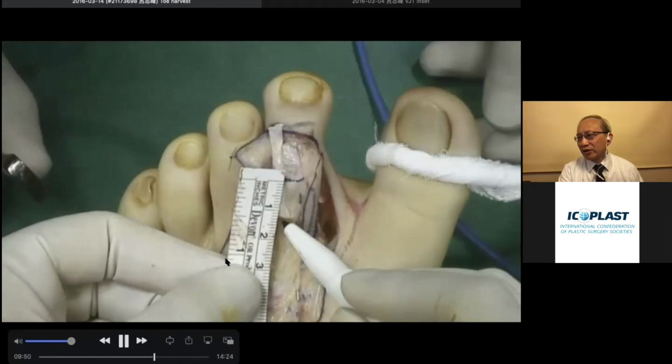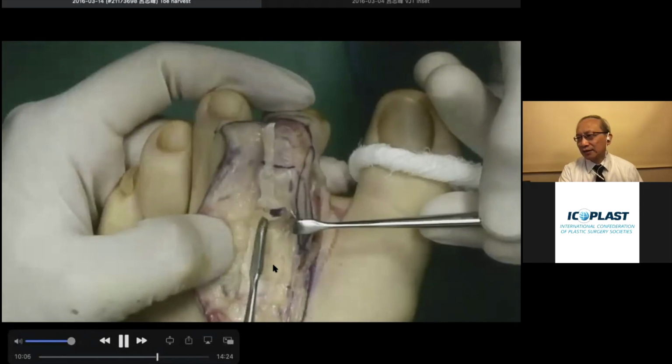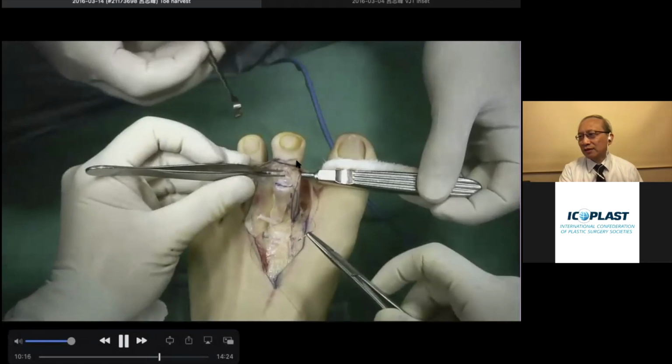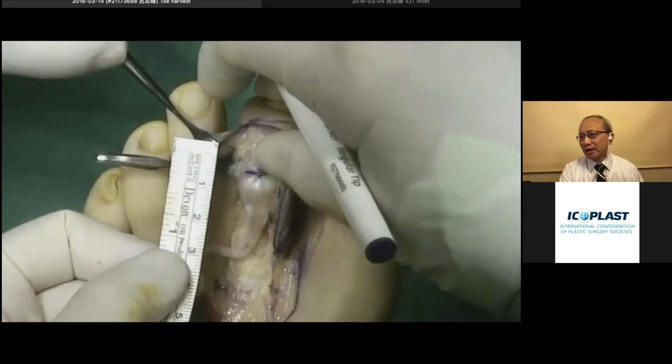Then I'll measure about 13 millimeter from the PIP. Again, although I measure here, we cut a little bit more periosteum from the donor side for coverage for the osteosynthesis later on. And we do the circumferential degloving of the periosteum. It's not necessary to place a suture, but it's easier to see, so I just put a suture there for when we do the osteotomy. So measure again, about 10 millimeter from the PIP joint, and do the cut.